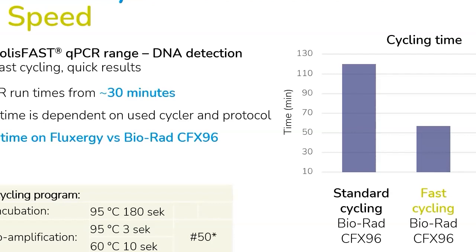And we were also very lucky to find out that when we applied our fast protocol, which is actually not the fastest that we can do, to a Fluxergy platform, we were also able to get really nice runtimes. And my colleague Reet will later also talk about these experiments, so stay tuned for that.